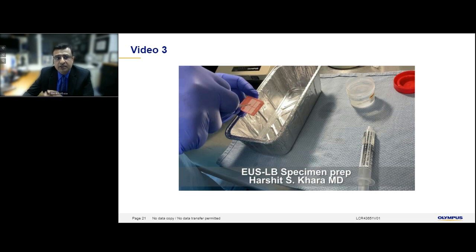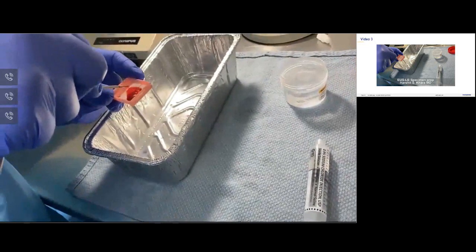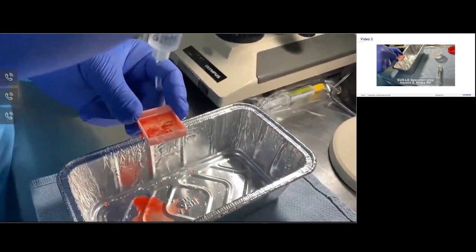Again, a drop of blood in a few cc's of water looks like a lot of blood, but basically when we send these specimens over, they are pure liver cores. So what we do is we take the needle and we move it over this plastic sieve. And then we use the heparin to flush through the needle. So for the specimen prep, we express the tissue by flushing the needle again with heparin over this sieve and then cleaning the specimen with sterile saline.